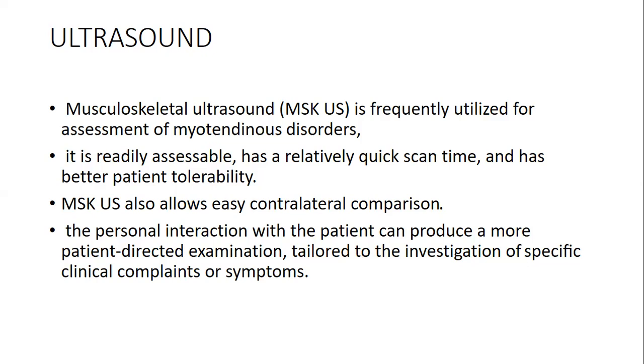The usual advantages are that it's readily available, has a relatively quick scan time, and has better patient tolerability compared to MRI, where some patients do not tolerate the scanner. Also, with ultrasound, you can scan both Achilles tendons for comparison.